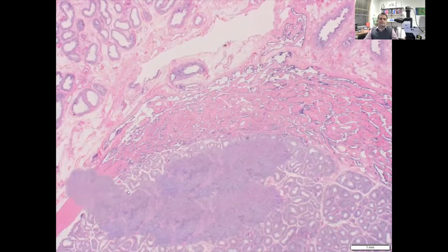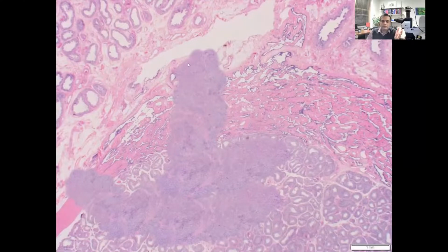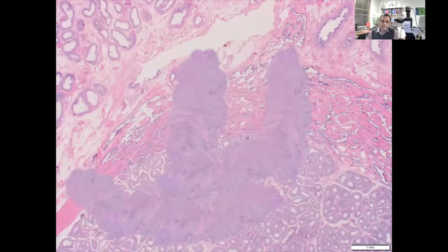You can classify something as a pT2 when it's invading directly through the tunica albuginea and then involving the hilar soft tissue. That is easy to diagnose because the plane is very well defined here. However, in this area where the tunica albuginea is not well defined, it gets a little more difficult to define the plane. In this example, you can see that the tumor is clearly involving the hilar fat, so that's easy to diagnose. However, there are many areas in the testicular hilum that do not have a lot of adipose tissue. So in an example like this, it might become difficult.